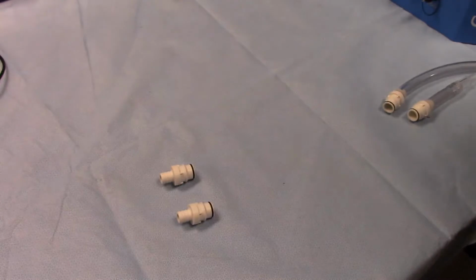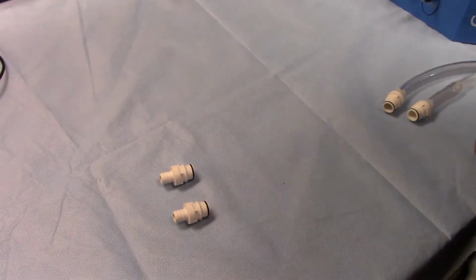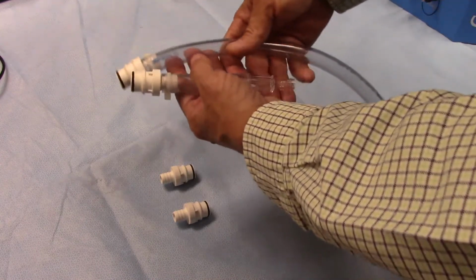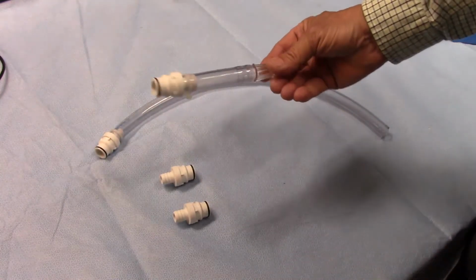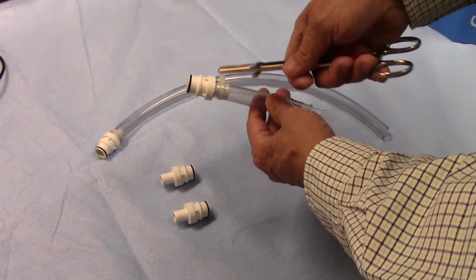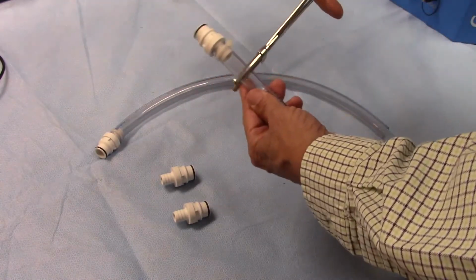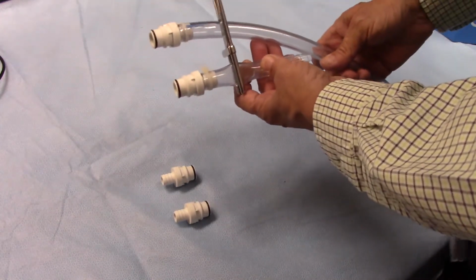The first step in connecting Califia to the ECMO machine is we take the standard connectors that come with it in the big valves, and we like to establish a couple of variations of a pigtail that might attach. So part of this thing is to put a tie wrap on there, make it really, really secure. What these allow us to do is then clamp later on and use these things quite frequently.